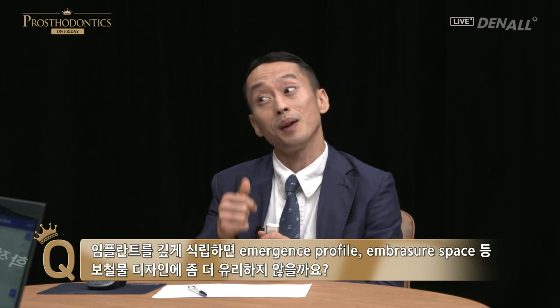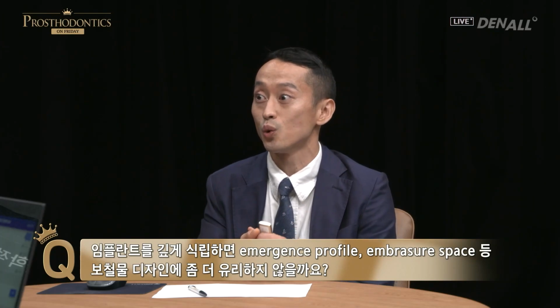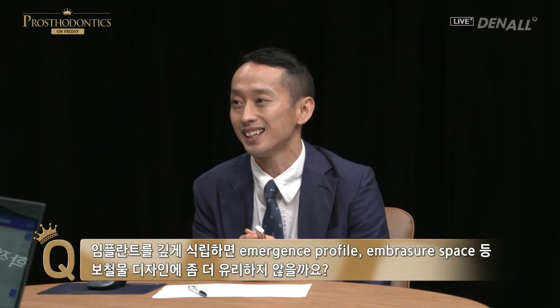Another point I want to mention is if the vertical space is lacking, there are many benefits to tissue level implant. But despite this, bone level implant are more favorable in that case. Thank you.